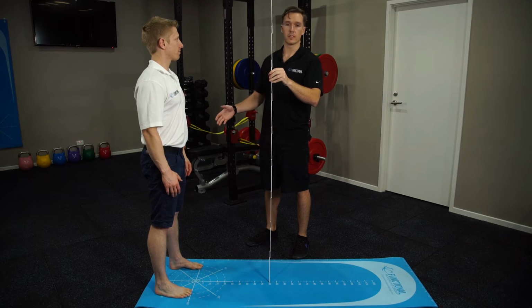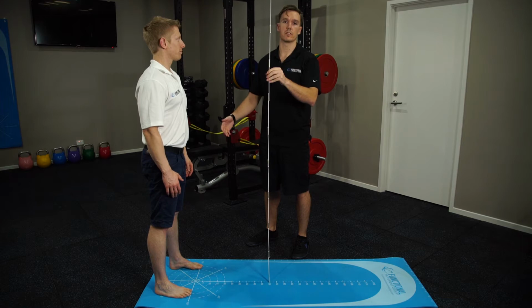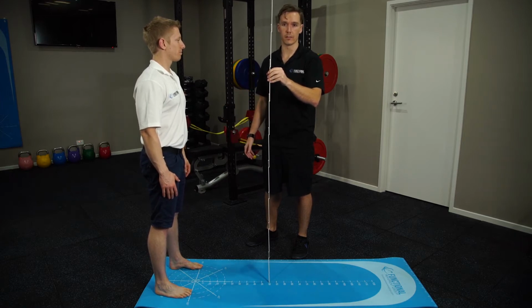We need to be able to do this because stability without mobility is just rigidity, and often mobility without any stability leads to injury. Having the patient set up on the mat, standing behind the 90-degree line, we can first assess the patient in terms of their spinal motion in the sagittal plane in flexion.